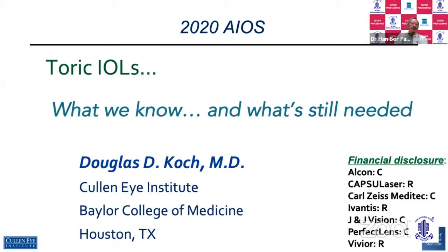I think that's a very good question. We haven't actually looked at this deeply. What we do know is that the Barrett and EVO, because we have good access to these two formulas, work quite well with ultrasound, with a bit of a change of the A constant. Haigis does not work well with ultrasound unless you completely change the triple constant. A simple single constant Haigis usually doesn't work very well with ultrasound. So that's my take on this.